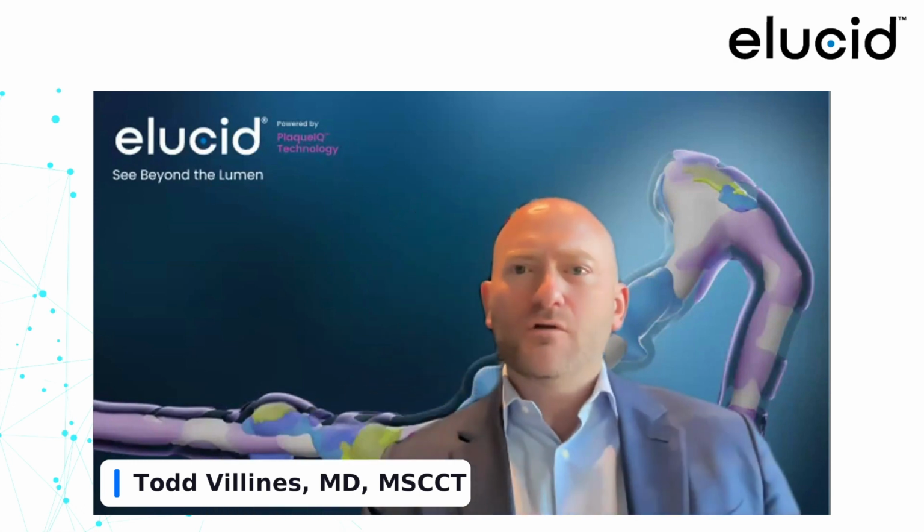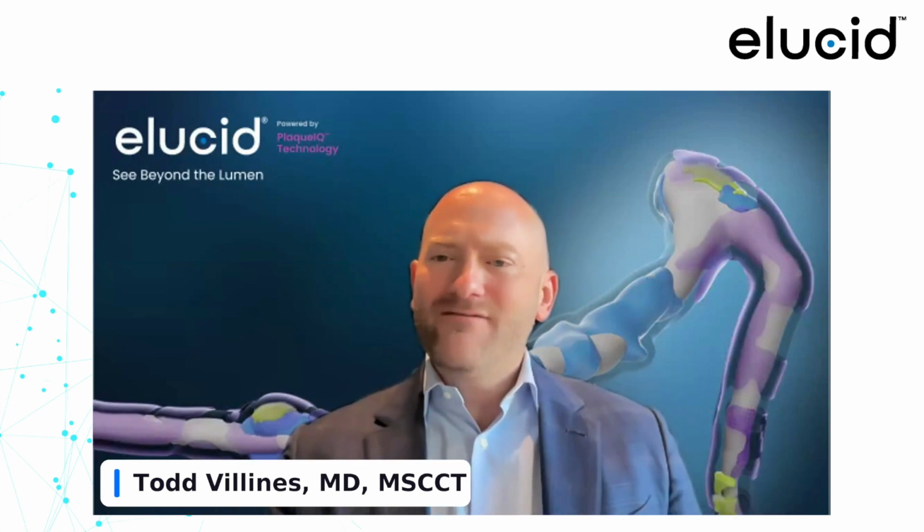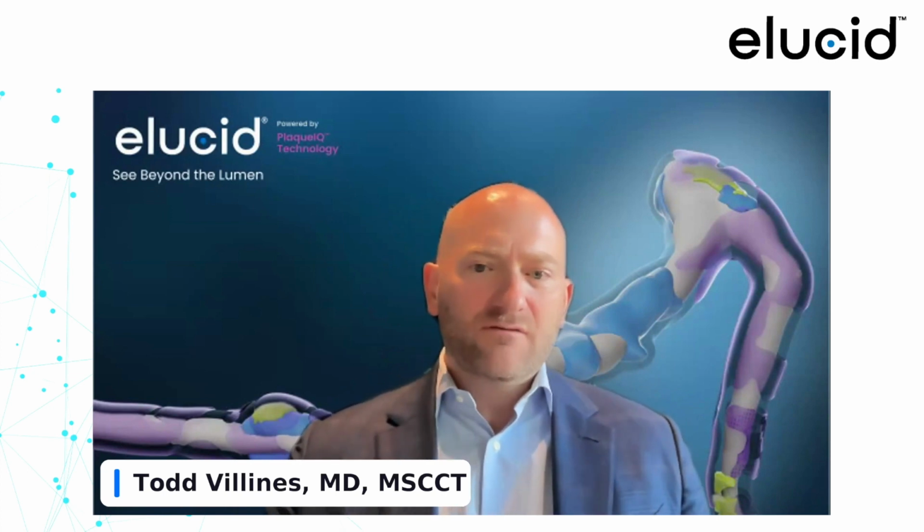A couple other questions have come in, and we'll try to get to these quickly. In a comment here, that IV is short term, et cetera. Maybe use oral. I think we've all experienced that people have taken oral, that we get a more stable and perhaps enduring heart rate control. Nitro. I know in our practices, we always give nitro. I guess from Lance and Patricia and Eric, how much nitro? When do you give it? Do you always give it?